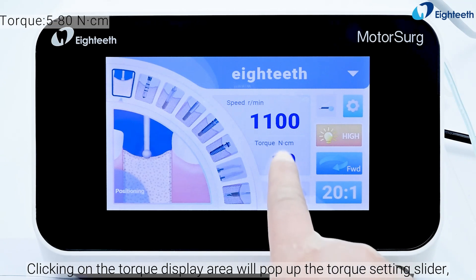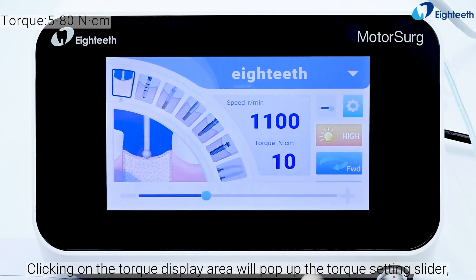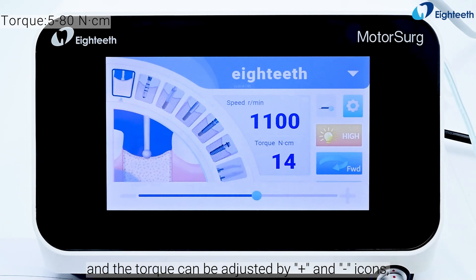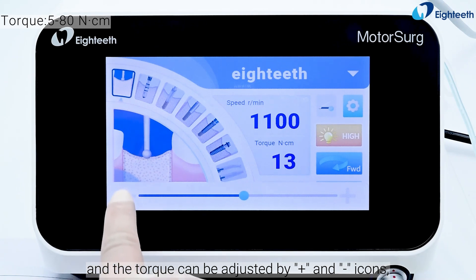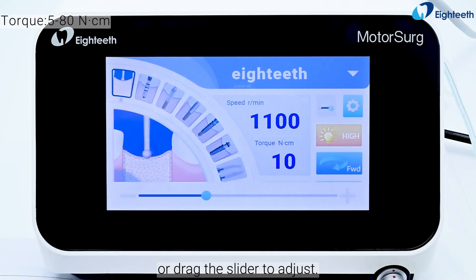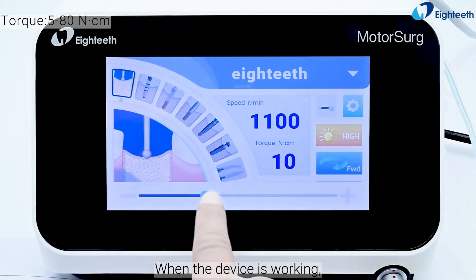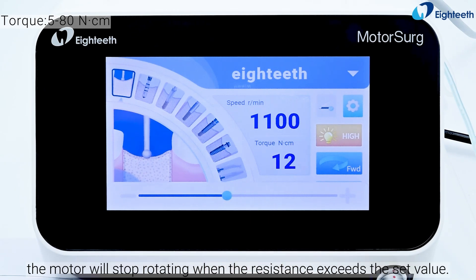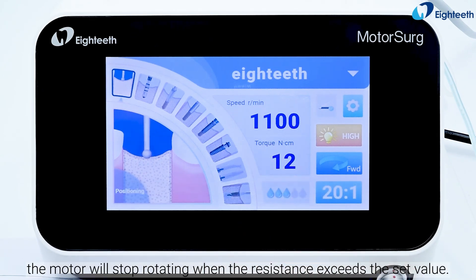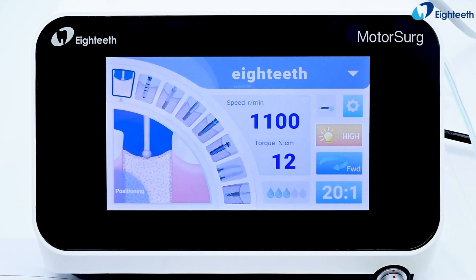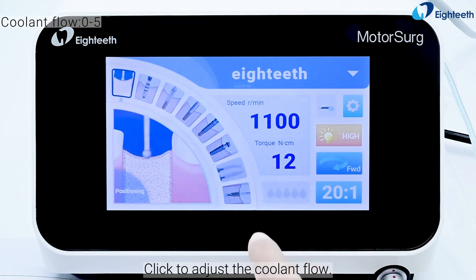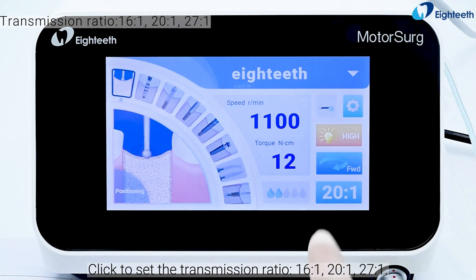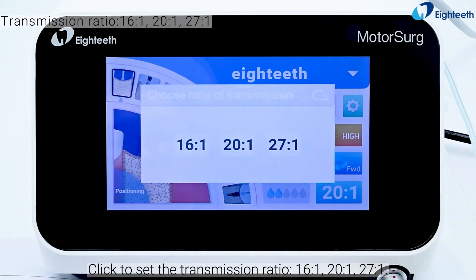Clicking on the torque display area will pop up the torque setting slider, and the torque can be adjusted by plus and minus icons or by dragging the slider. When the device is working, the motor will stop rotating when the resistance exceeds the set value. Click to adjust the coolant flow.